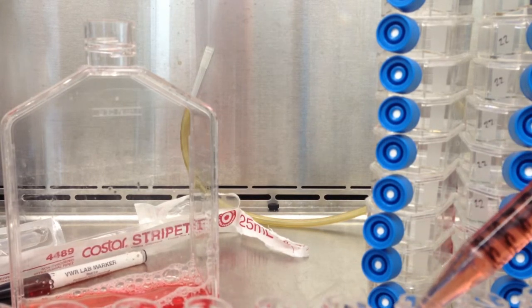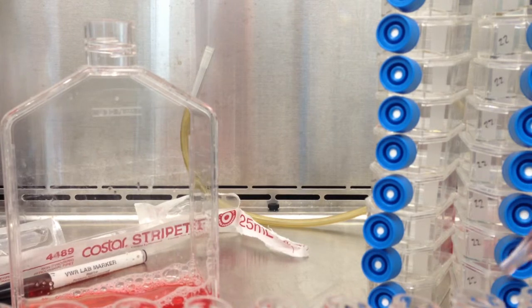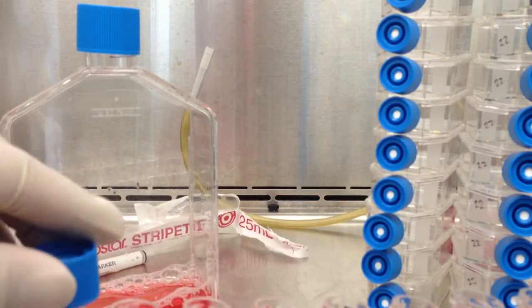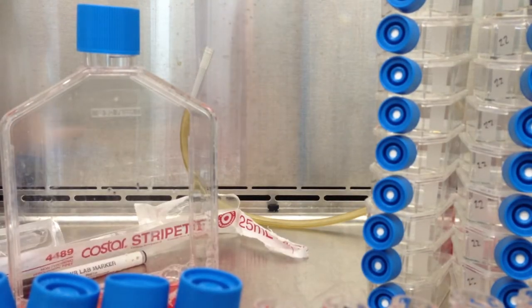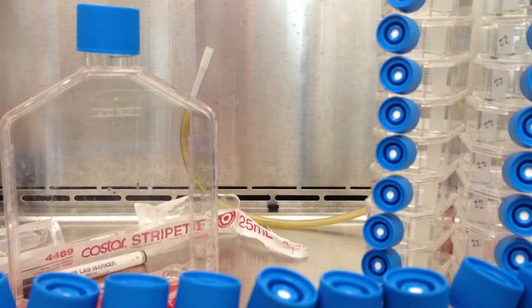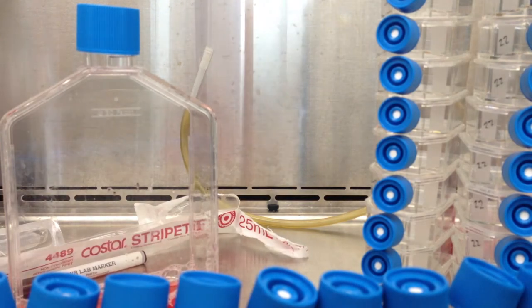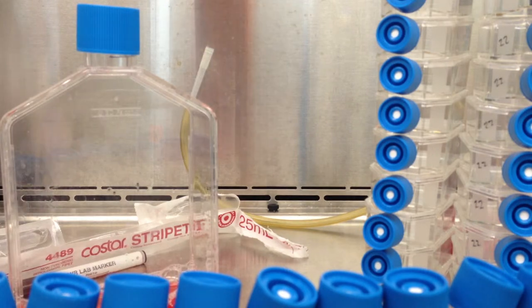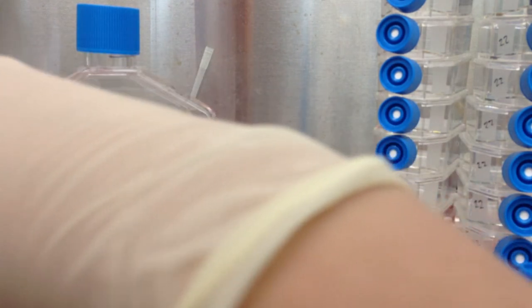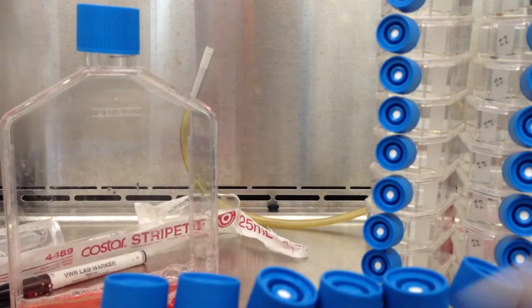I'm going to change my tip after this. Okay, I'm going to change the tip of this because I think I touched the side of the flask. I'm going to just put the caps all back on. I'm going to throw this away. Another one. Let's spray it again, just 2 at a time. Just close the caps. At least you don't have to do it 2 at a time. I just did it because I have big hands.